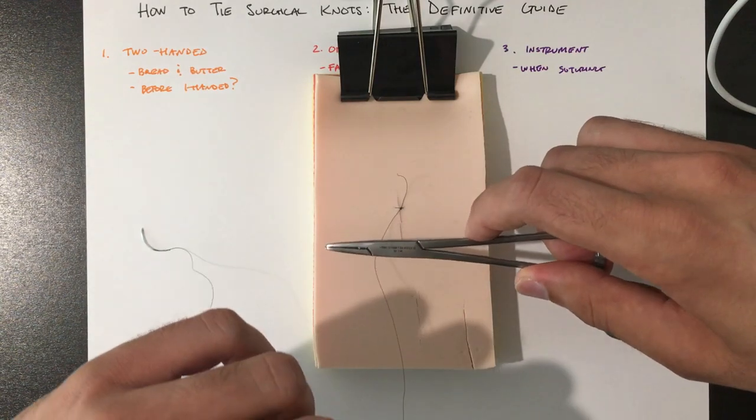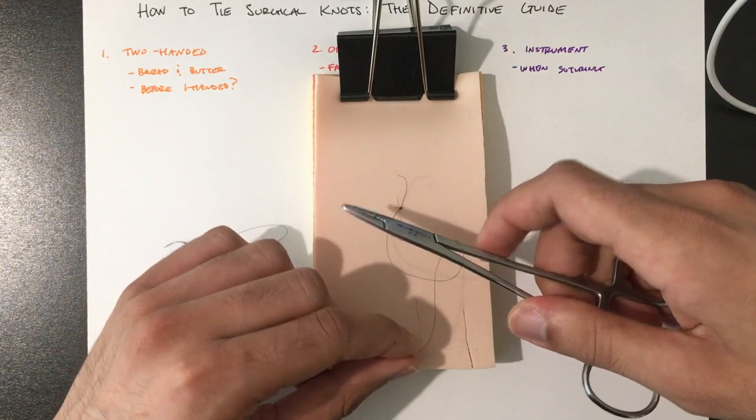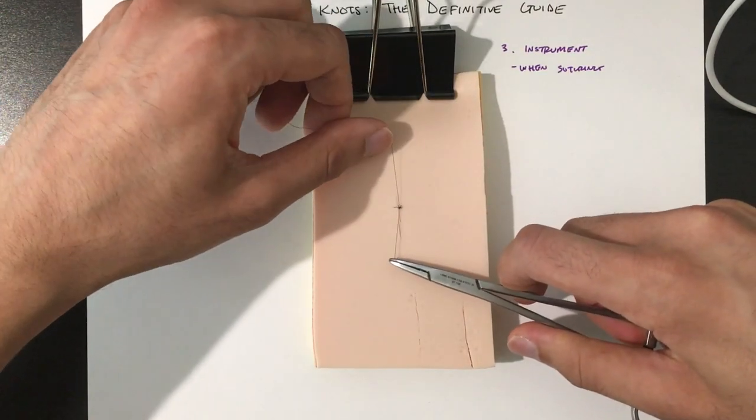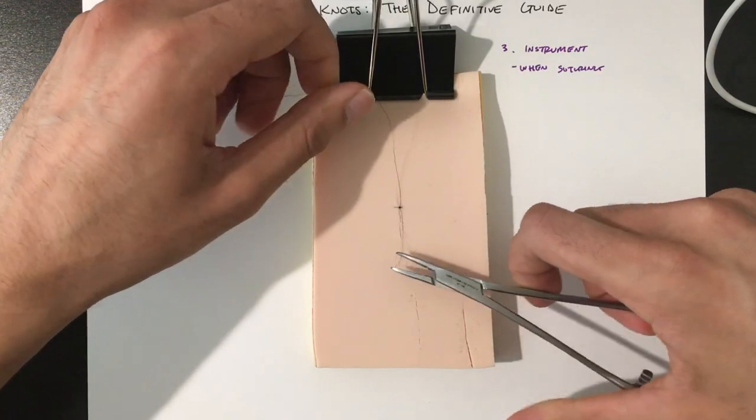We're in the middle, wrap from outside in, grab the short end, and pull through. Take a look.